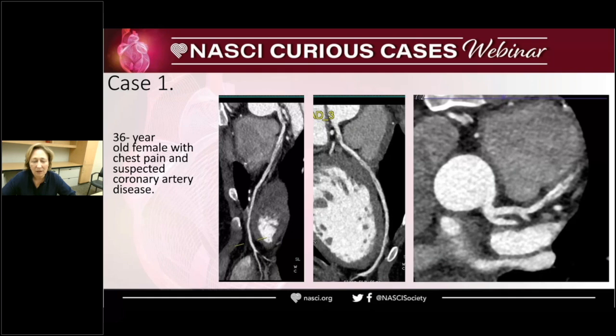So would you think that there's a stenosis in the LAD? What we describe? So again, looking at the image on the far right, in the mid LAD, I think there is calcified plus soft plaque. It's a mixed plaque. Right. So what he's saying is the expansion of the size of the vessel, right? So the vessel is dilated compared to the proximal portion of it, and it looks a little bit irregular, and there's a soft tissue component associated with that dilation, right?